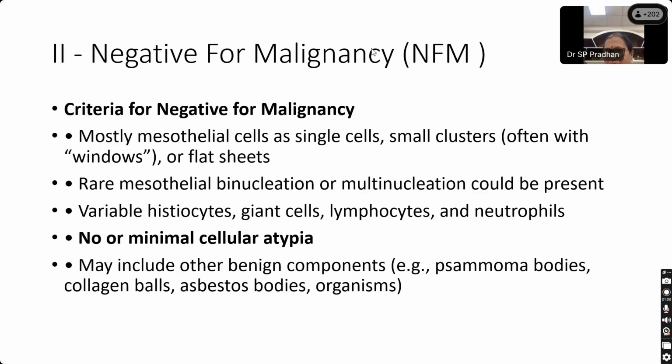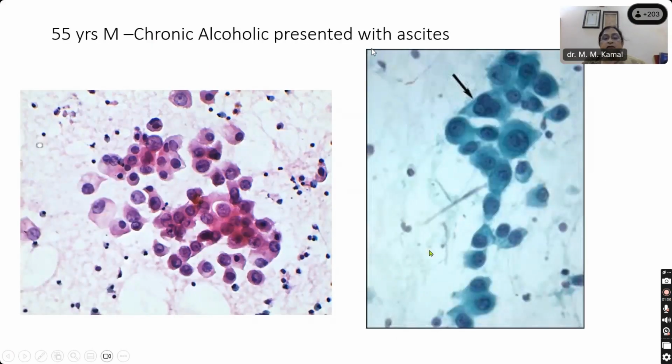That's very much required, very perfect and apt points that needed to be highlighted. Now, in the same chain, yes, sir? Another point which I wanted to add was that many times, if the effusion has been there for a longer period of time, you will get a lot of degenerated cells. So you might have to ask the clinicians to please submit a fresh specimen. Yes, we'll come to that also, and how we have to request for that.